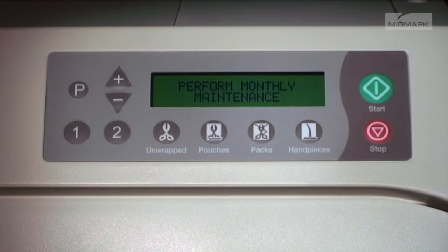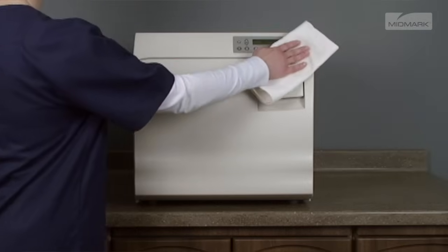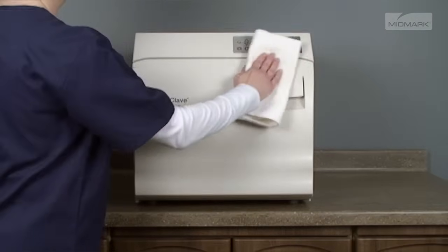Every 28 days, the autoclave will automatically display the Perform Monthly Maintenance message. This is a more thorough cleaning of the unit and involves multiple steps.